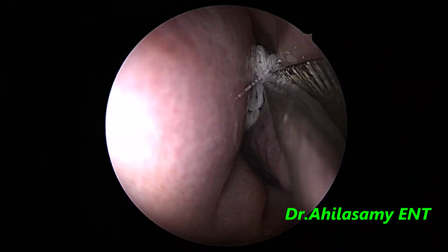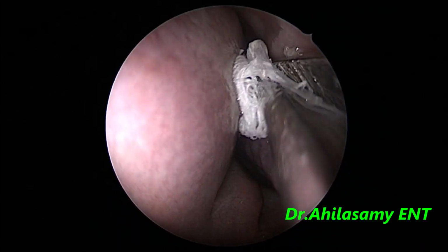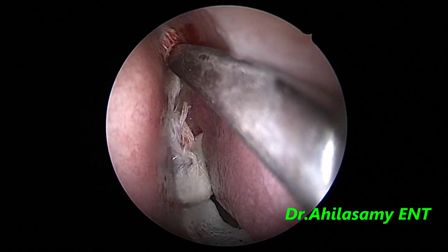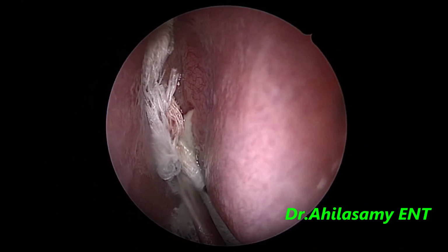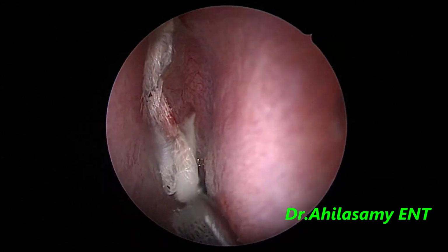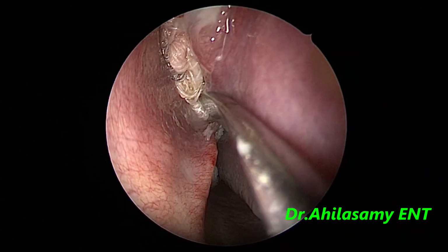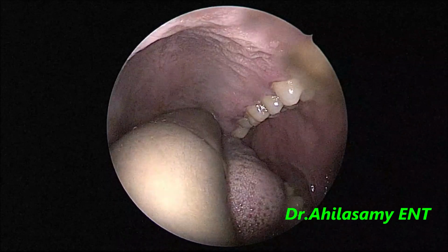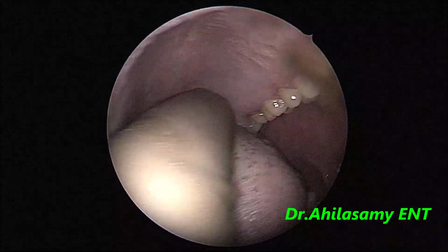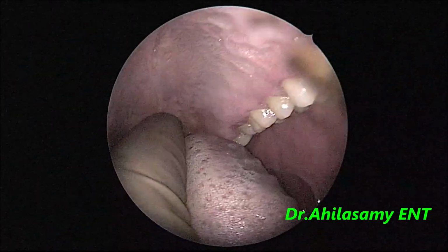First, I am packing the nasal cavity and the middle meatus repeatedly with roller gauze soaked in 4% lignocaine and adrenaline in the ratio of 1:1, that is 10 ml of adrenaline and 10 ml of 4% lignocaine.